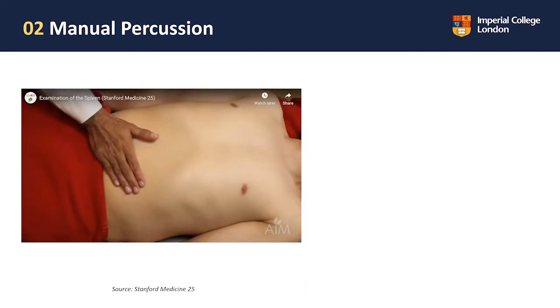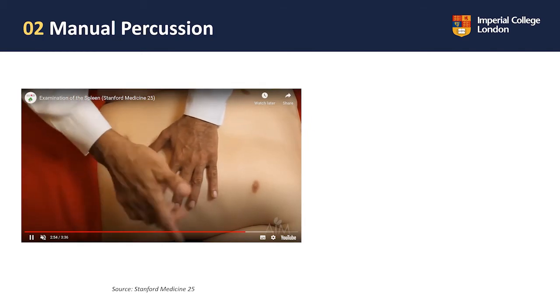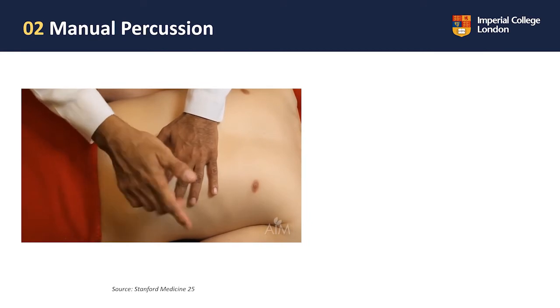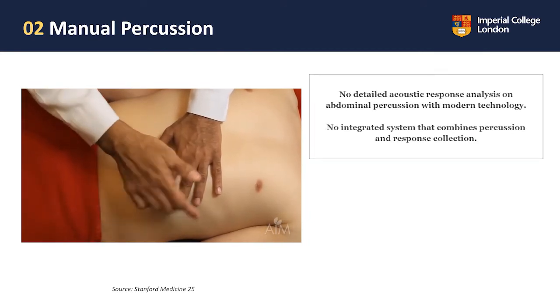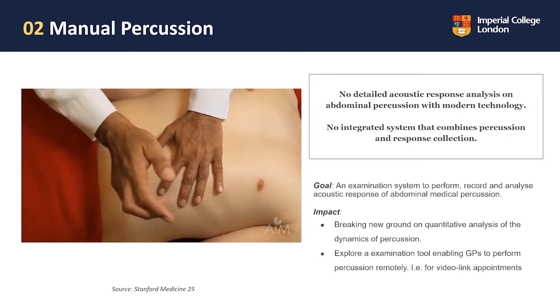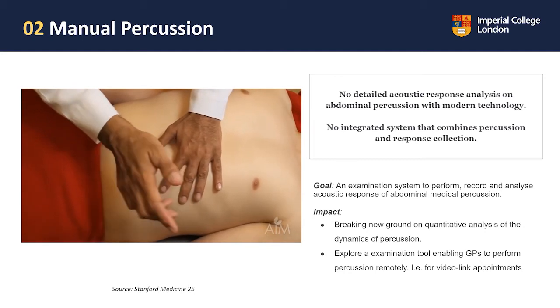Medical percussion is a diagnostic procedure used in clinical examination whereby the chest, back and abdomen are tapped to determine the condition of underlying tissue through the acoustic response. Although percussion is common in medical practice, there is a limited understanding of its dynamics. The goal of this project is to create a robotic system to perform percussion and record and analyse the acoustic response.